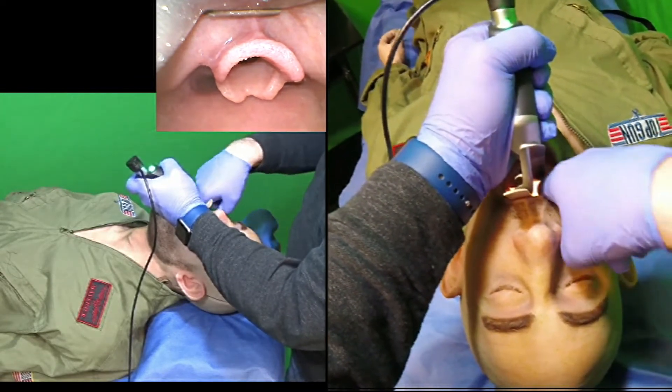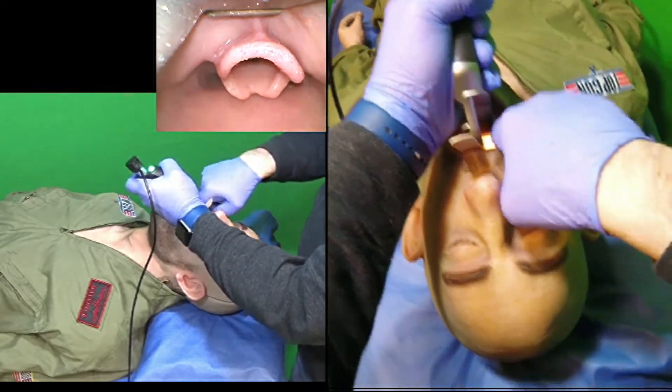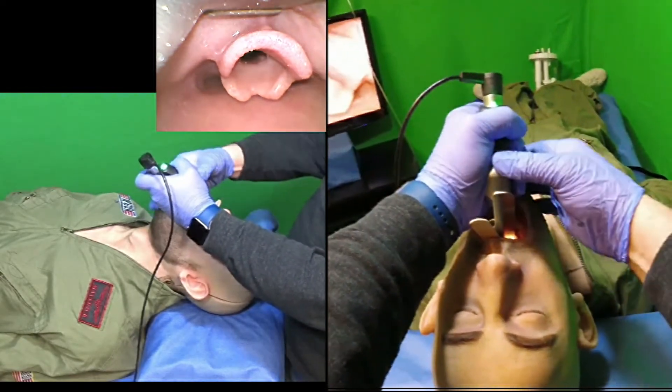Another skill is to create room for tracheal tube delivery. I call this the salad poke — it came from the salad technique where I put my finger into the right corner of the mouth. In this case, I can see the larynx under direct laryngoscopy just as easily as I can on video.